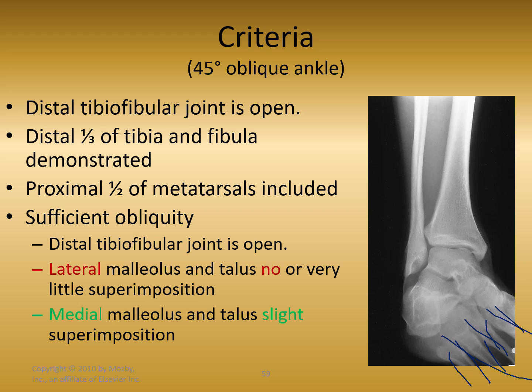All right, but we're seeing distance here between the lateral malleolus and the talus on the lateral side, but over here, the medial malleolus is getting really close to that talus and maybe superimposing into the talus on the medial side, because we're turning the foot pretty far medial, right? So it only makes sense that those medial structures are going to start to superimpose over each other, where the lateral structure is going to kind of spread out and be separated from one another.